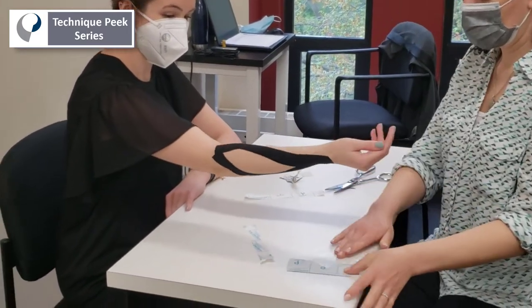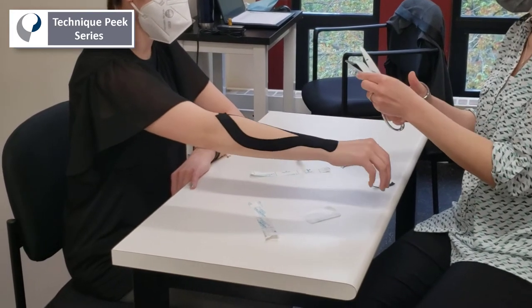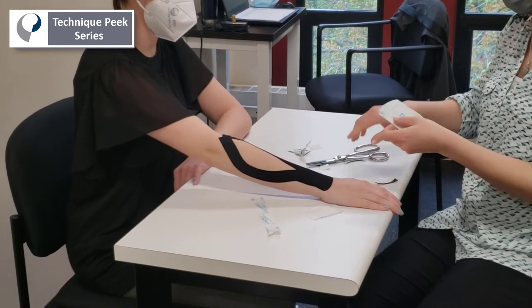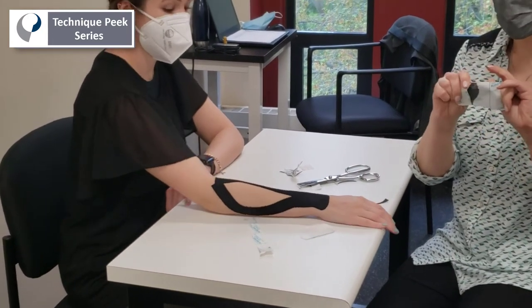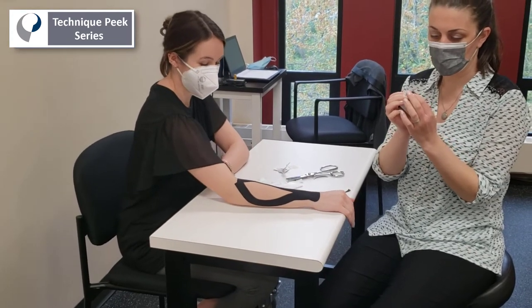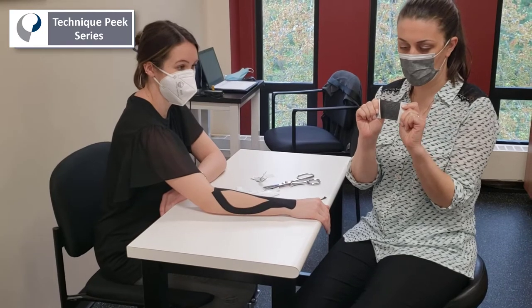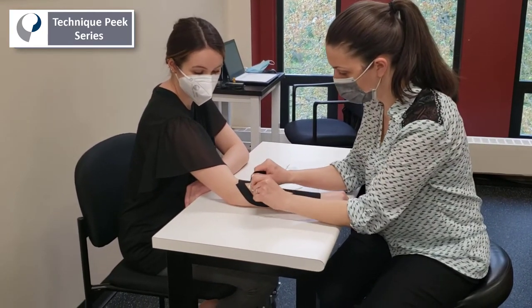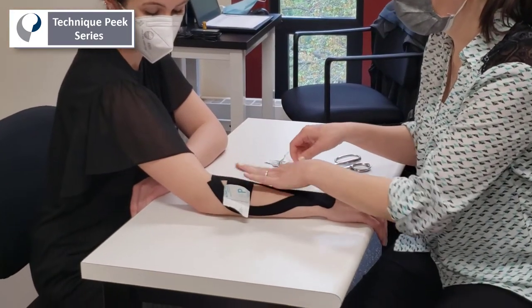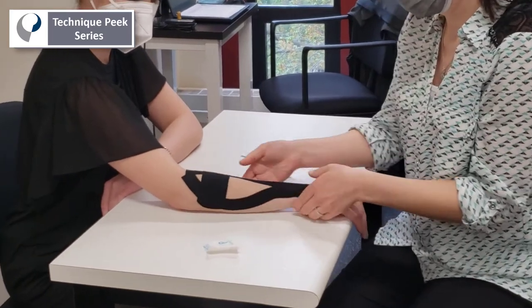The last piece is going to be to lift the pressure off of the extensor wad. For this the patient can be relaxed. You're going to tear the tape at the middle and pull back the edges. You're going to pull it a hundred percent and then let go of fifty percent — so fifty percent tension right over the extensor wad. Then let the tension off of the ends as you lay them down. And that's it.